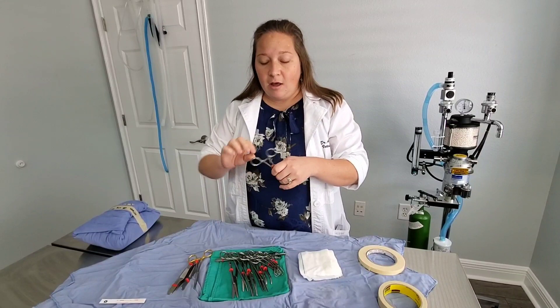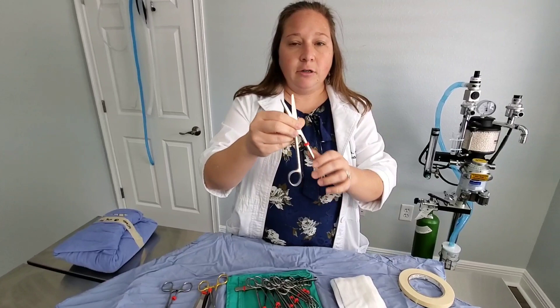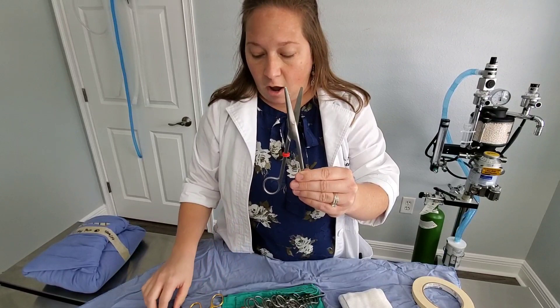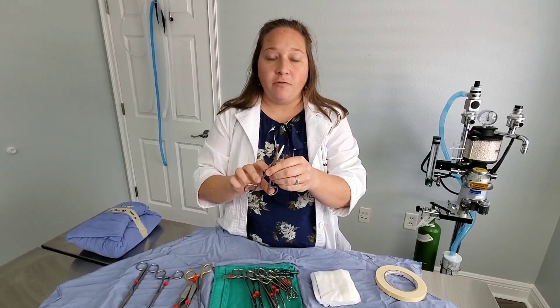A lot of times, if I'm not doing surgeries where I'm removing a lot of tissue, I'll use the Allis clamps to clamp my drape to my tray to keep my sterile field continuous. These are called operating room scissors — sterile scissors that we use to cut drapes, cut suture, or anything that needs to be cut in the OR.